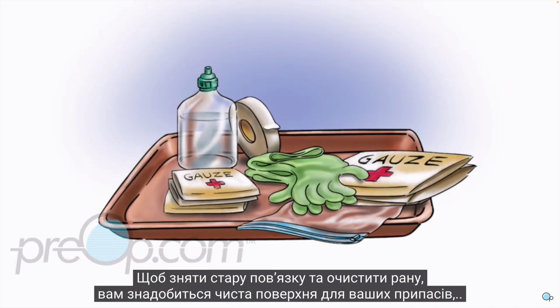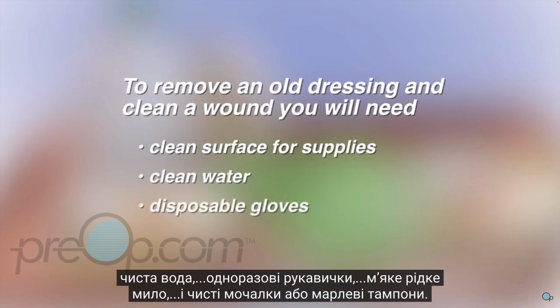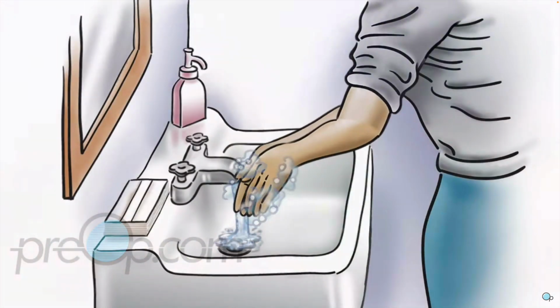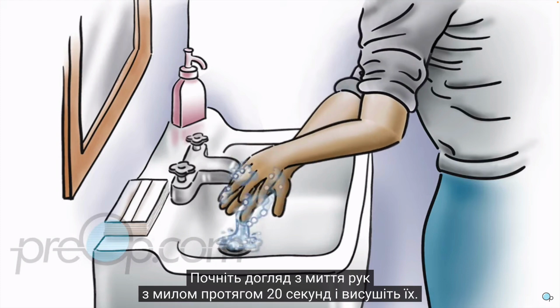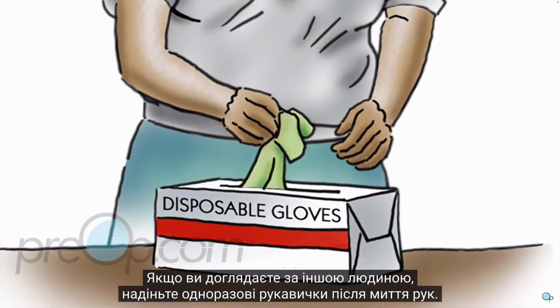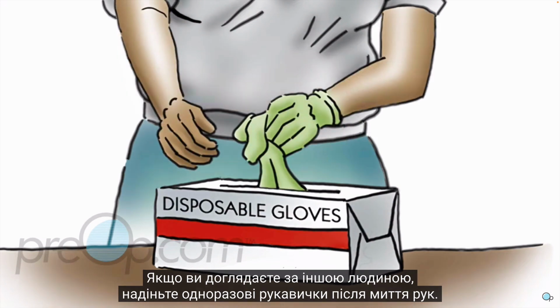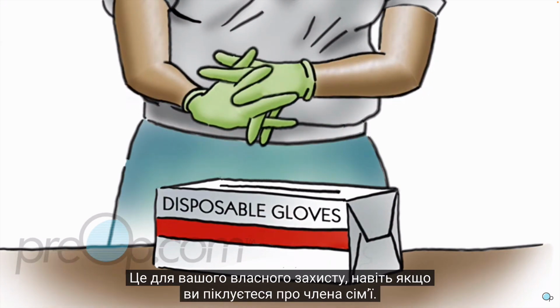To remove an old dressing and clean a wound, you will need a clean surface for your supplies, clean water, disposable gloves, mild liquid soap, and clean washcloths or gauze pads. Start all care by washing your hands with soap and water for 20 seconds and dry them. If you are caring for another person, put on disposable gloves after hand washing. This is for your own protection, even if you are caring for a family member.